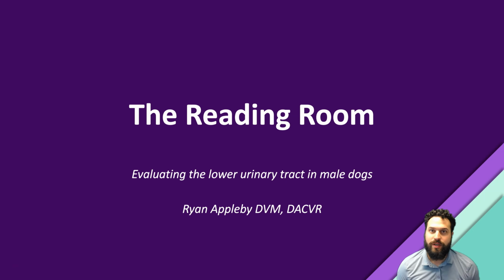So this week we are talking about evaluating the lower urinary tract in male dogs. It's not uncommon that you're going to see a male dog present to your practice with evidence of either stranguria or maybe even other types of urinary presentations, hematuria, and we're going to need to look at those cases radiographically to see what might be going on.